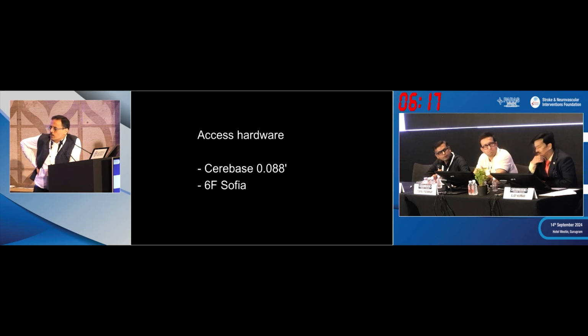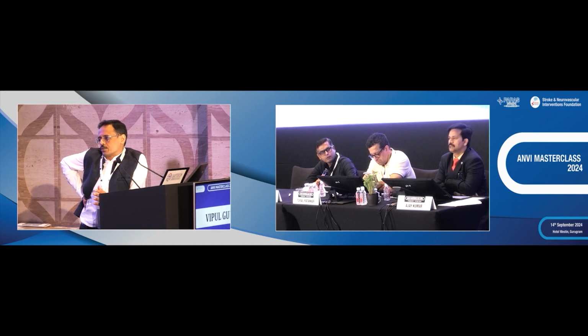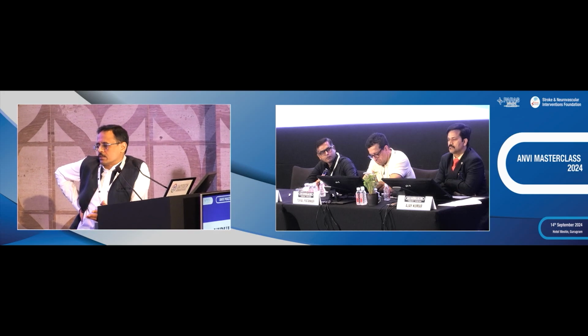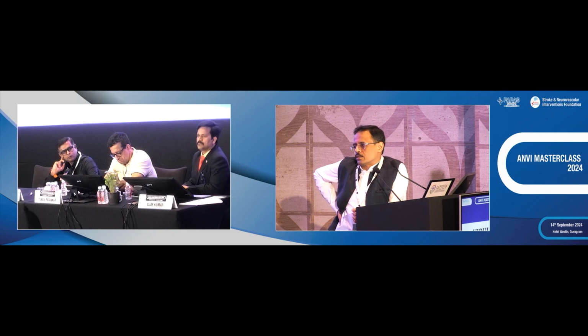Yes, once you do angioplasty and everything, of course you keep the wire across, because at that time you're already into this PTA stenting mode. But initially, no. But we do inject injectable agents. If there is any chance of it remaining patent, it's because this is a ruptured plaque with a lot of platelet aggregation happening. So we start giving them antiplatelet agents for sure, because otherwise it's not going to remain patent, whichever way you do it, whether it's just stent or angioplasty or stent, you need injectable agents to keep it patent, in our experience.